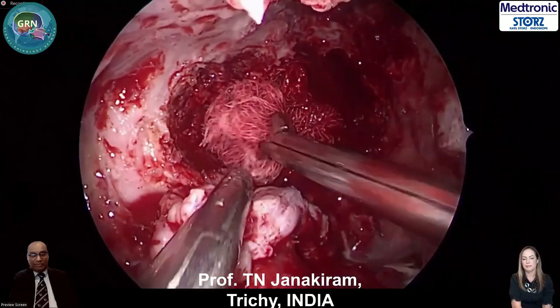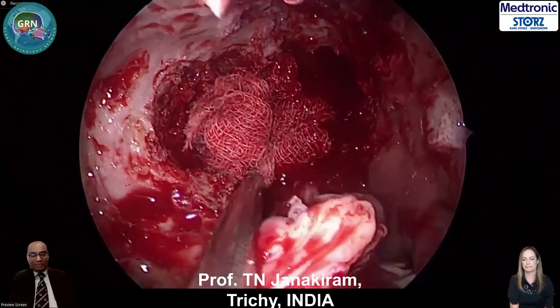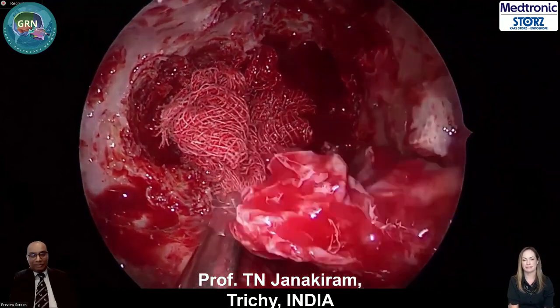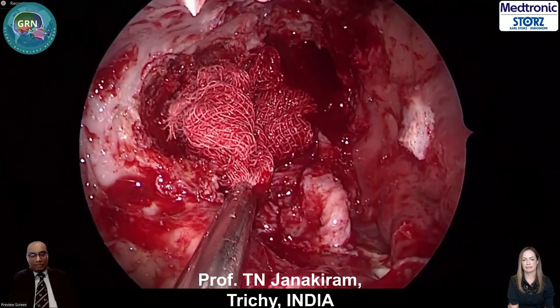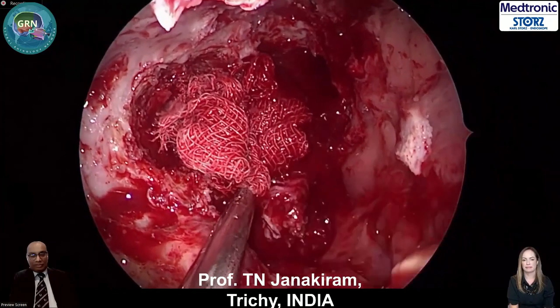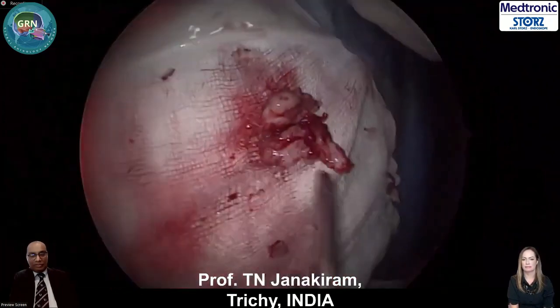So at the end of the surgery, you should see that's just the tip of the iceberg. So I've removed the tumor here. Okay, that's the tumor. Show the tumor. This is just the tip of the iceberg.